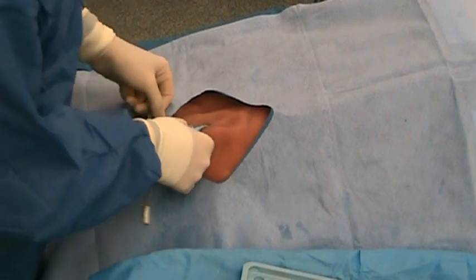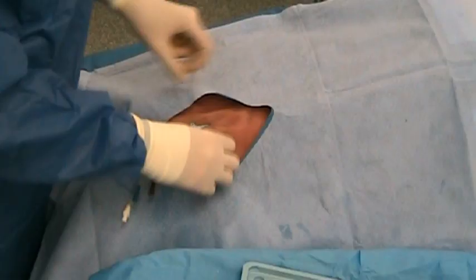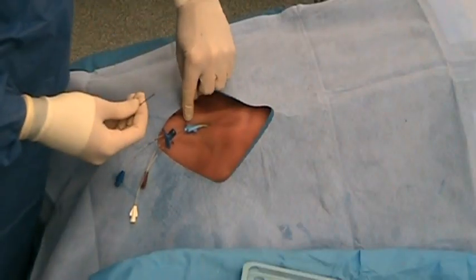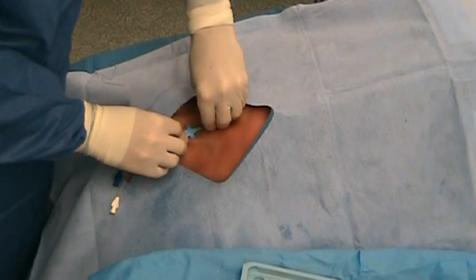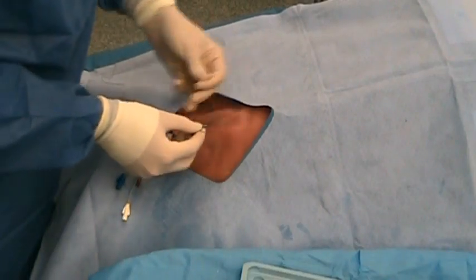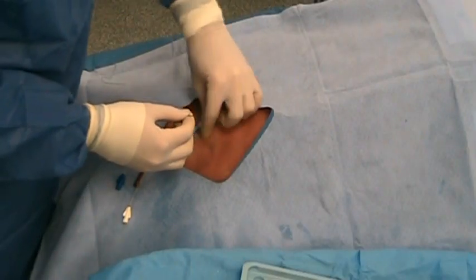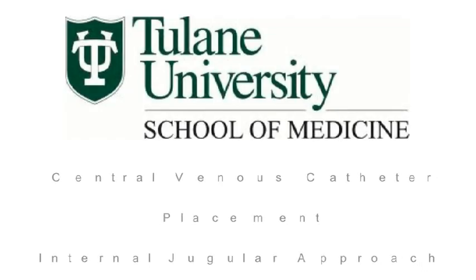The catheter is now affixed in place. The included suture is used to suture the catheter clamp to the skin. The biopatch and sterile dressing can now be applied.